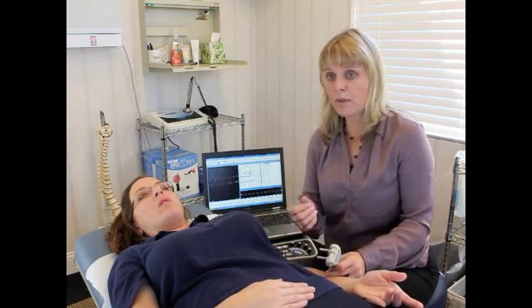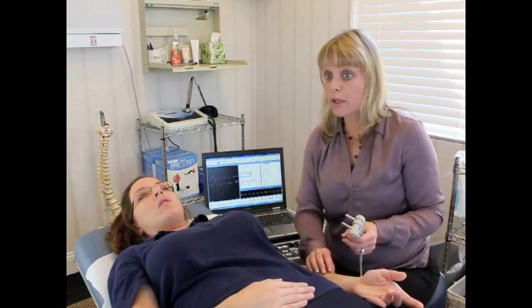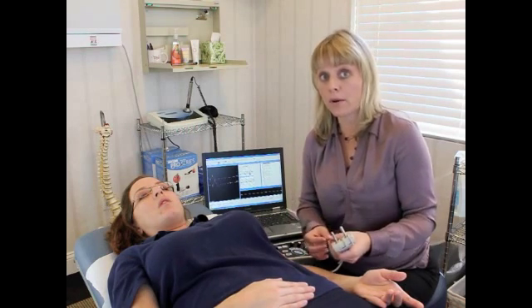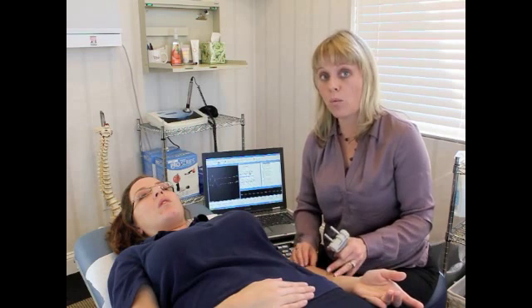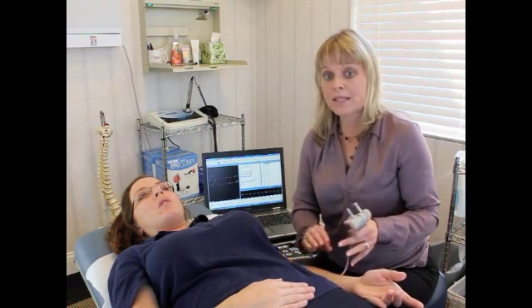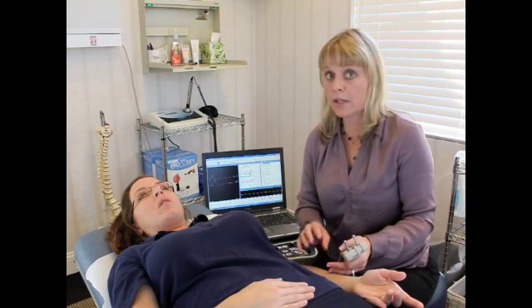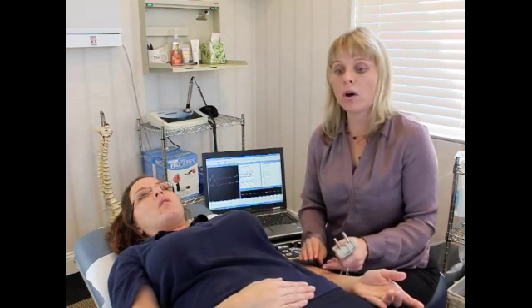Sometimes you might notice that you feel weakness in your arm. Perhaps you're dropping things. Maybe you feel like your muscle doesn't look like it's the same size from one arm to the other. This test can determine all of these things to give you an answer as to what is going on. Same thing happens in your leg. Maybe you're dragging your leg. Maybe the leg doesn't look the same size in your calf. Maybe you feel like your toes are dropping. Whatever the case may be, we're able to determine all of these things through nerve conduction studies and EMG.